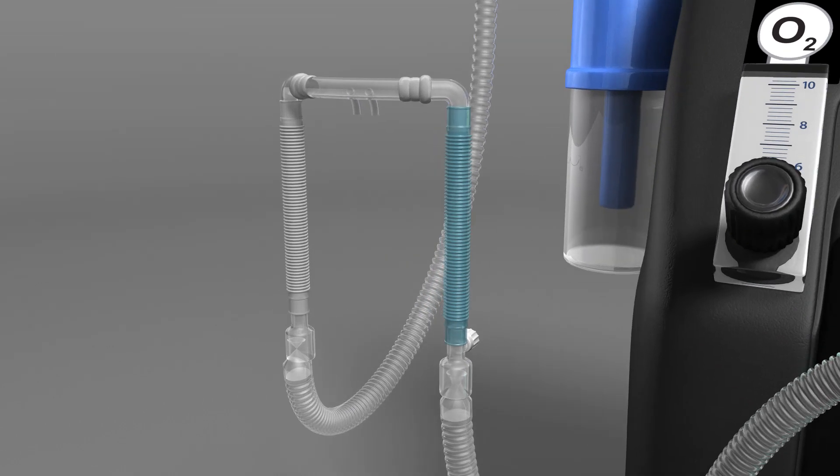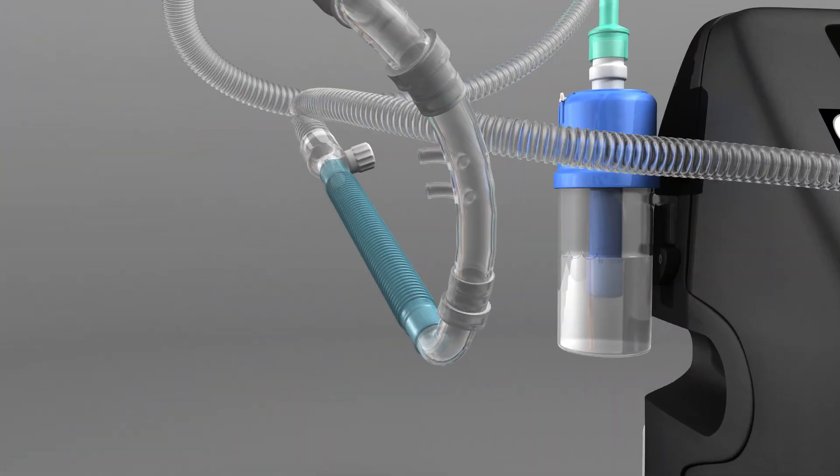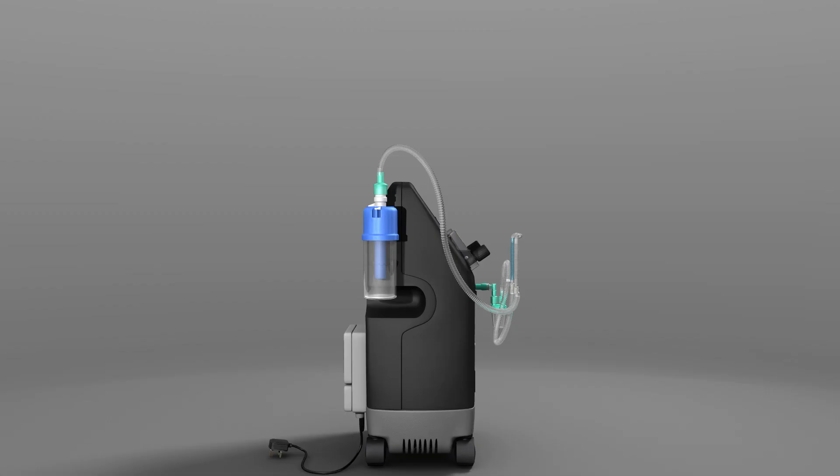Ensure that flow is coming through the nasal cannula. Place the cannula into the patient's nostrils. Use the bonnet to help secure the equipment and use the chin strap to minimise leak through the mouth.